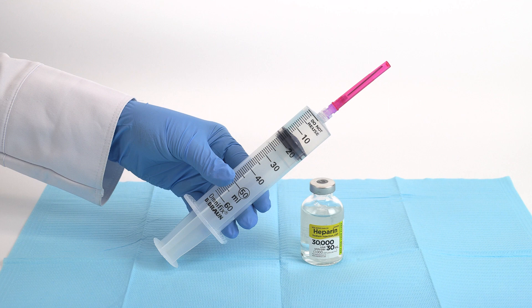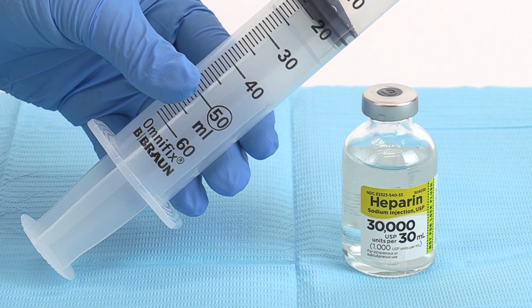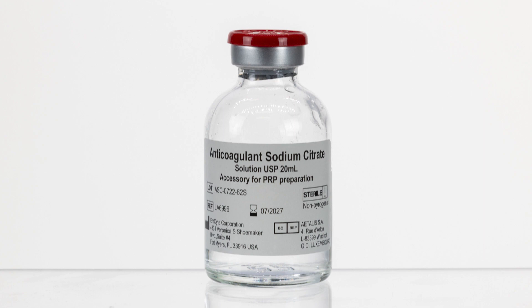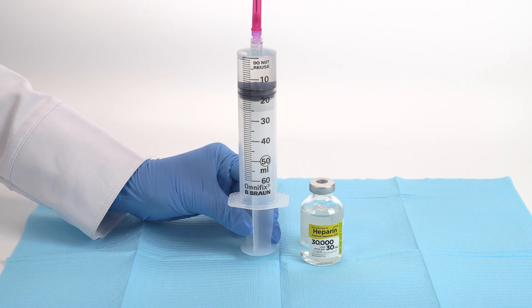First, we will begin with priming the bone marrow needle and filter. Use heparin solution 1000 units per milliliter as the anticoagulant of choice. You may also use citrate anticoagulant if heparin is not available. To begin, aspirate 15 milliliters of heparin into the 60 milliliter syringe.